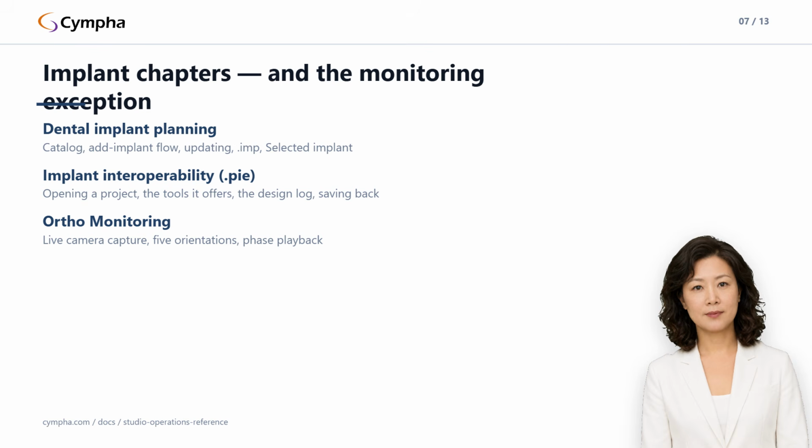The chapter covers capturing patient photos through the live camera preview with the model overlaid, the 5 orientations, front, left, right, upper, and lower, how Studio proposes the phase number from the treatment start date and the days per step, and phase playback, including why a missing phase honestly says no photo for that phase yet instead of quietly substituting an earlier photo.